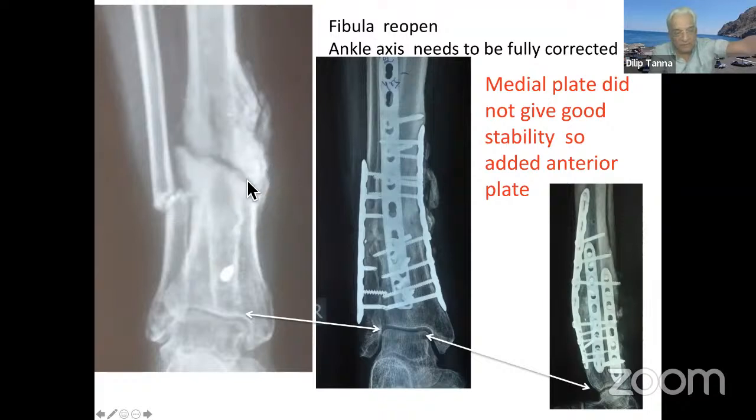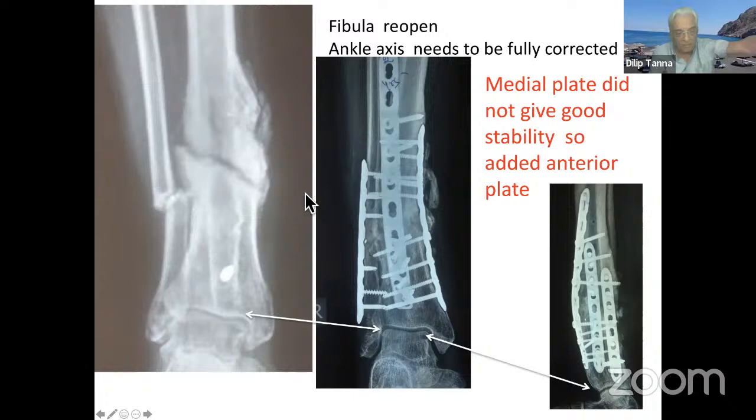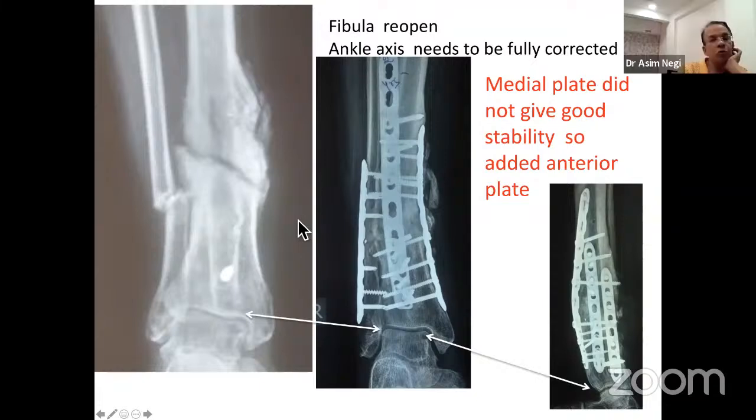This case, I felt it is not required anymore. I have not done it anymore, because the edges were not sclerotic. No. All the sclerosis is all here, peripherally. So you used a compression device to correct this? Yeah. Otherwise, this will not correct. In the old non-union, it will not correct.